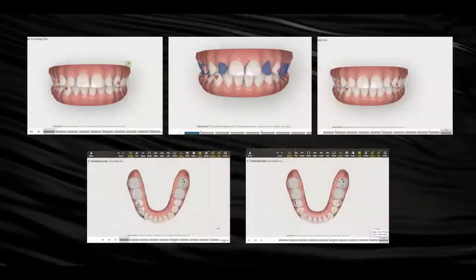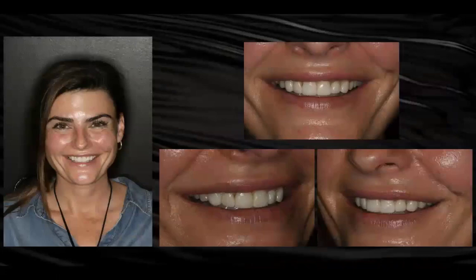She liked it, but you know what? I said, do you really want to look like that? Because your front teeth just look too prominent there. And I showed her with Invisalign doing a design on that. She saw, wow, I could conserve tooth structure and save money. So this is her before and this is her after. She's much happier, and she also didn't have to spend so much money here.